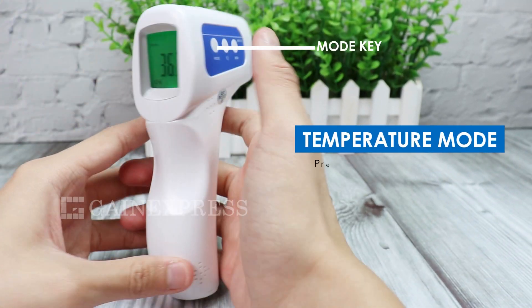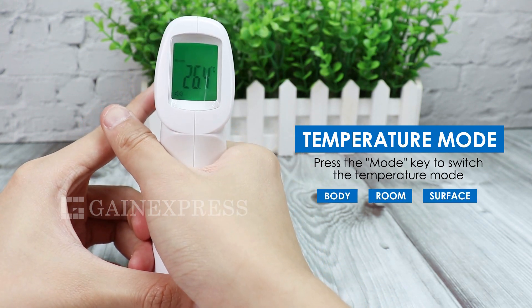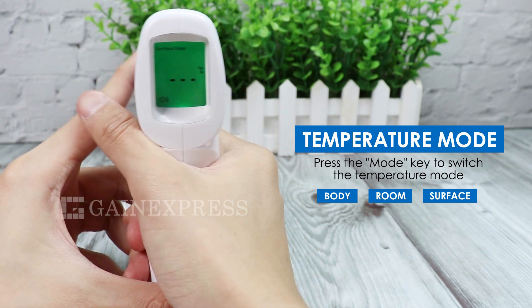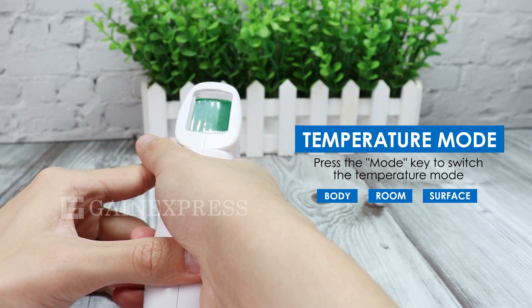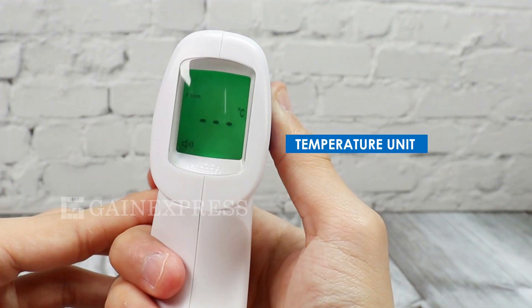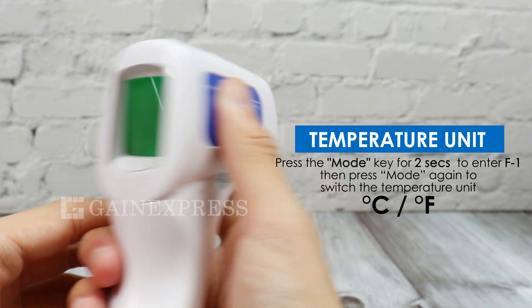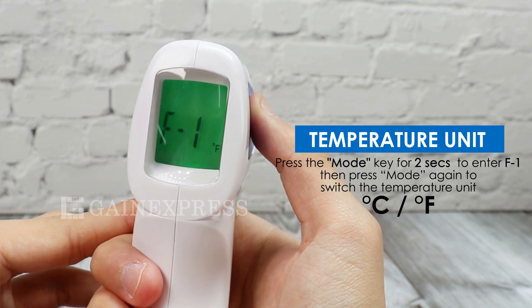To change the temperature mode, press the MODE key. For the temperature unit, press the MODE key for two seconds to enter F1, then press the MODE key again to switch the temperature unit.